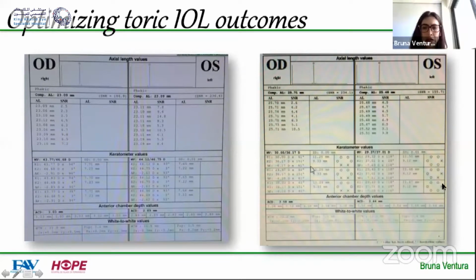So it's very important for us to take into consideration the quality of the exam. Most times we see that the exam has a lot of interference secondary to, let's say, an important dry eye, and we can treat that and revert it and get good quality of measurement, which is wonderful. Sometimes the quality of the exam is not so great because of an underlying disease, let's say an important corneal degeneration, and you can't really change that.